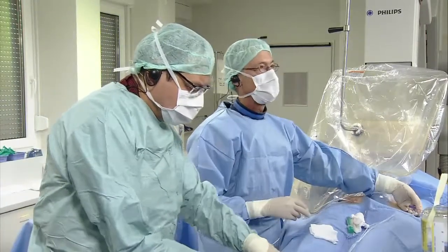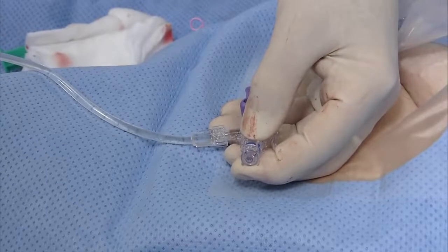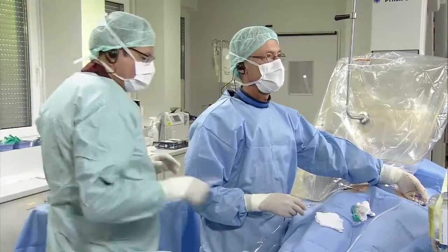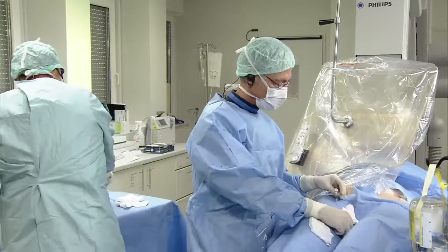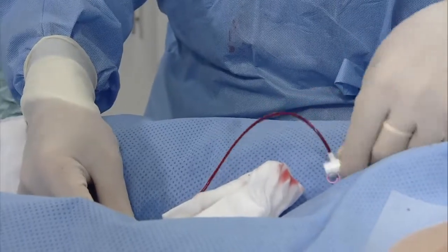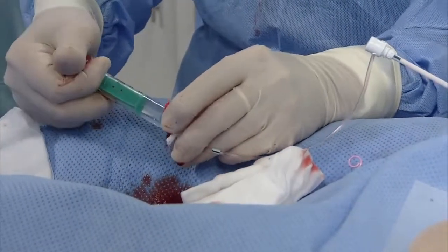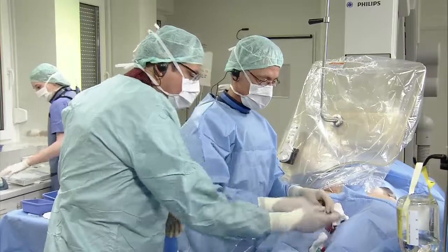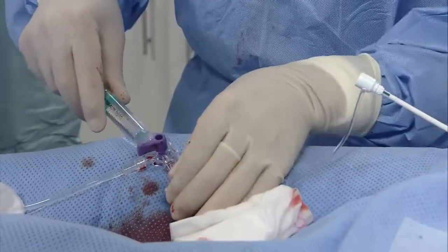Then at what stage do you think about giving fluids? That's what we do if the pressure is too low. We are just rechecking 0. Okay. Let's de-air the sheath, very important, of course. Keeping the hub down, turning the sheath around to make sure that there's no air in the valve. My perception is that now we will give heparin 10,000. May be different for you, Horst, but my perception is that we're a little more assiduous about checking the left atrial pressure and giving fluid if the left atrial pressure is low.